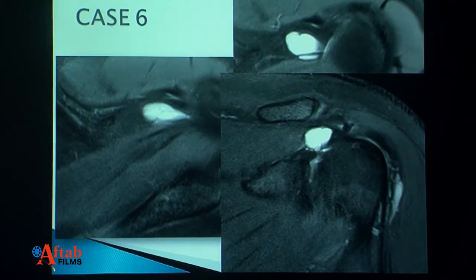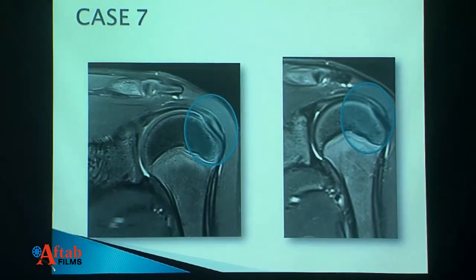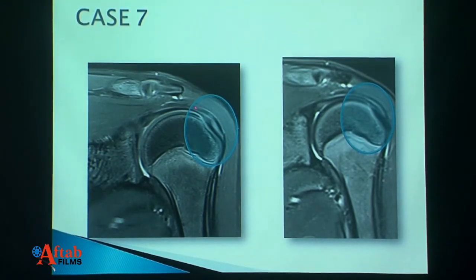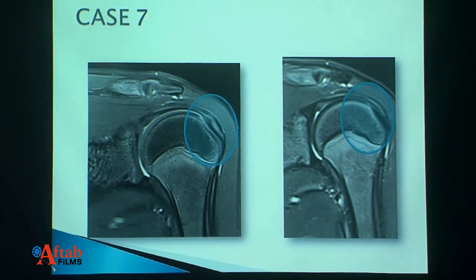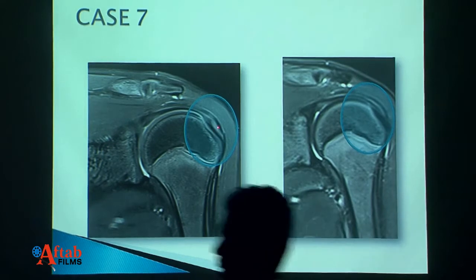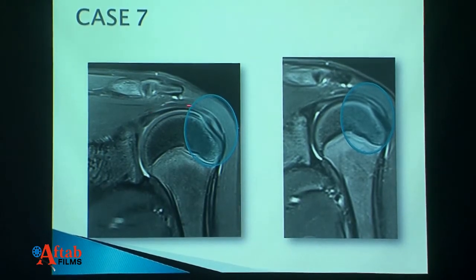Look at this patient — this is an immature skeleton, and when you see signal extending right up to the footprint of the supraspinatus in such an immature skeleton, it is nothing else but a fleshy insertion of the supraspinatus. There are no significant tendinous changes. As the patient ages, this migrates proximally and becomes less fleshy. This should not be labeled as pathological — you have to be very careful, especially in the immature skeleton.